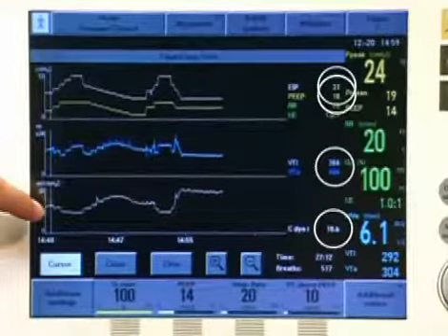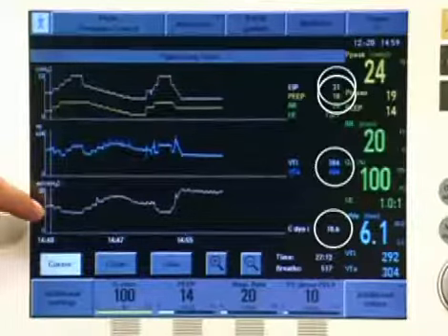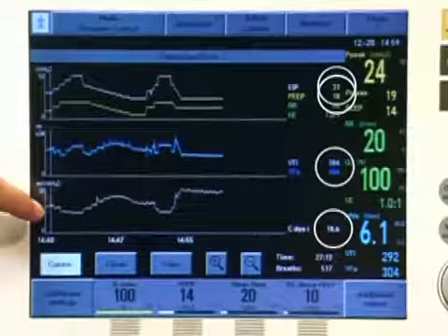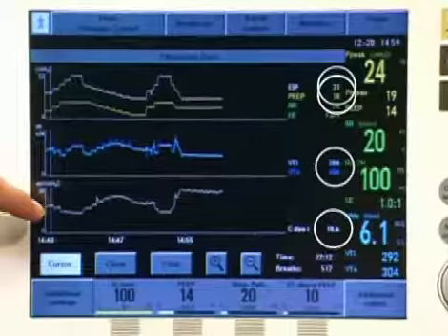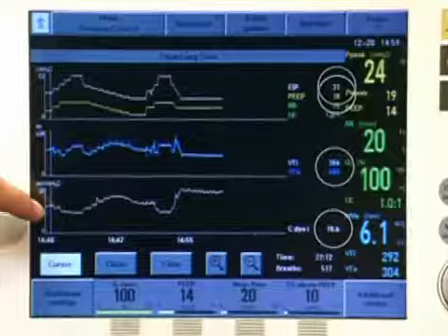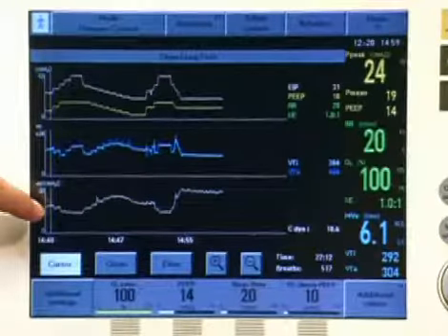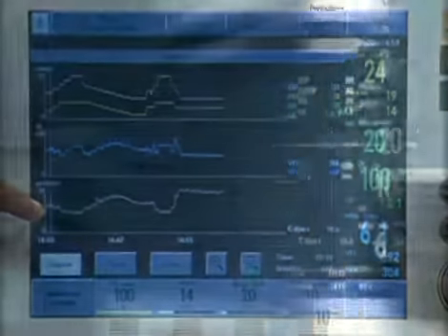In a first clinical evaluation, in which the changes in compliance have been compared with the changes in oxygenation, results have shown that compliance is a useful clinical parameter that can determine the efficacy of recruitment and is able to detect lung collapse after recruitment at the bedside.